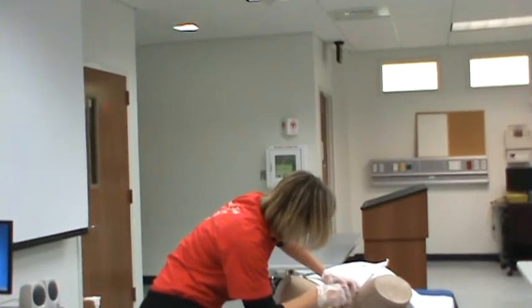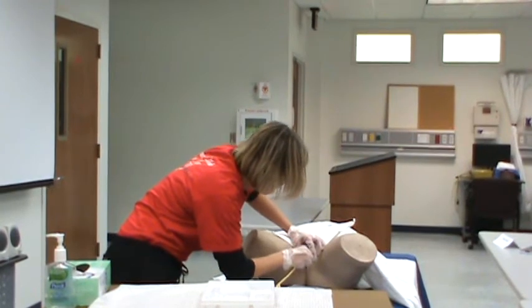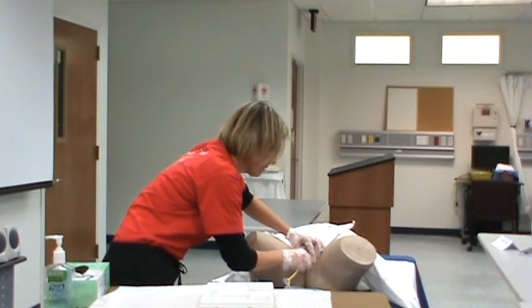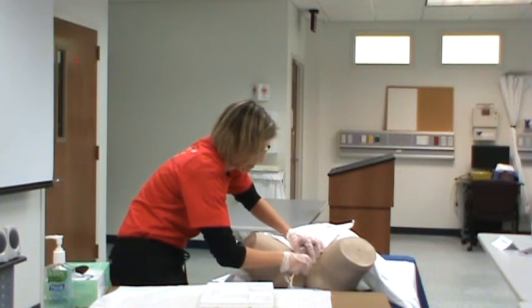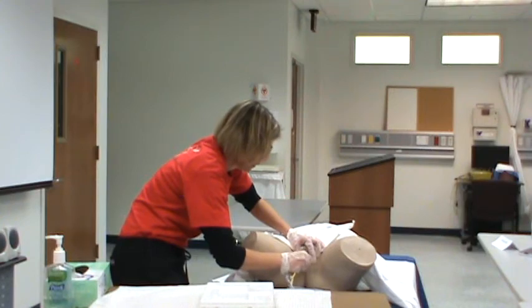Okay, Mrs. Smith, I want you to take a deep breath for me. And it distracts them as well. And now as you're inserting, sometimes, especially with mannequins, you might have to turn a little. Do not touch the labia. Walk your fingers back. Even though you cleaned it, it's not sterile, so you don't want to contaminate. So you go until you see urine. And I haven't seen urine quite yet. And we'll let you know when we see urine.